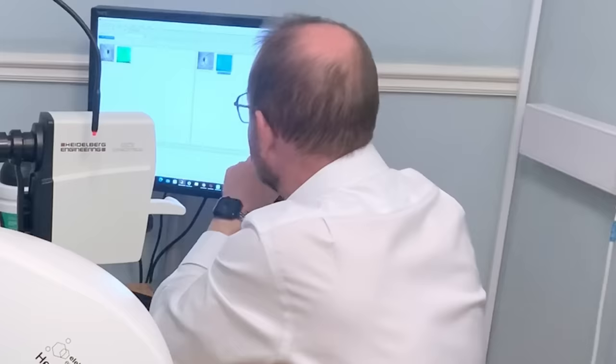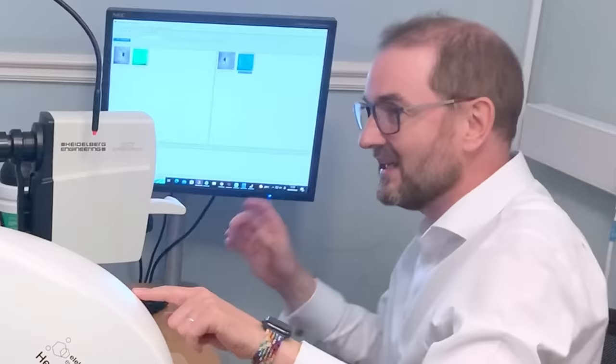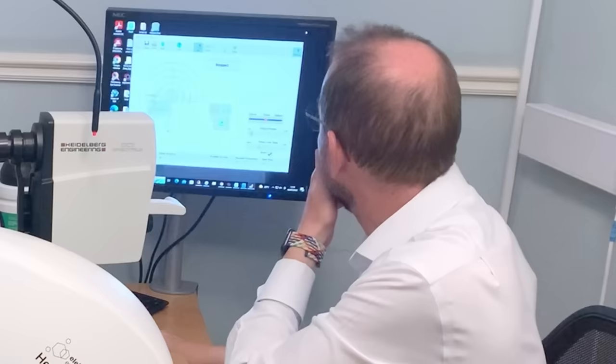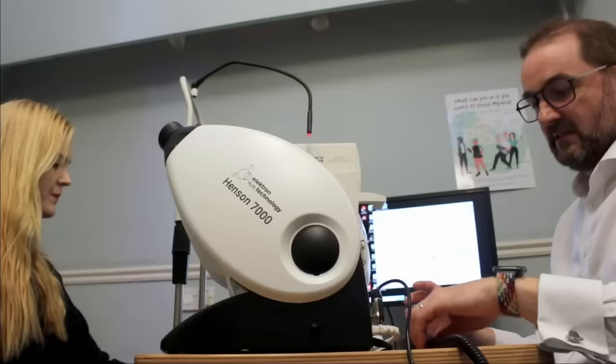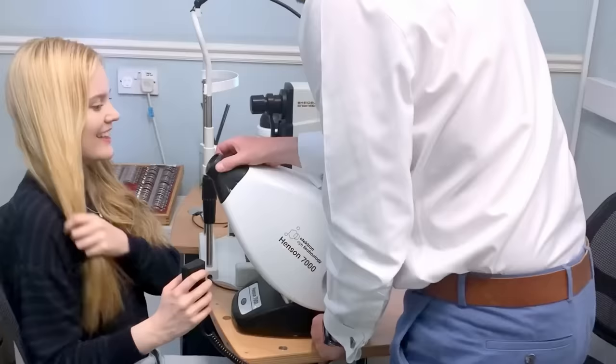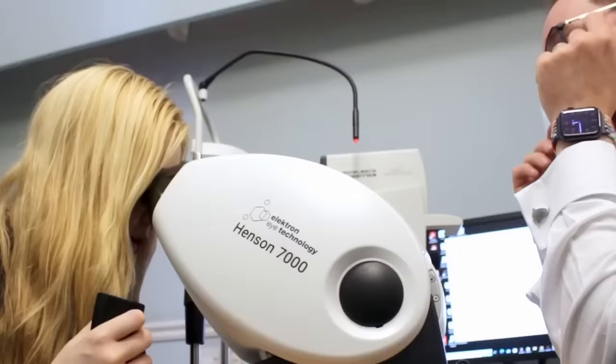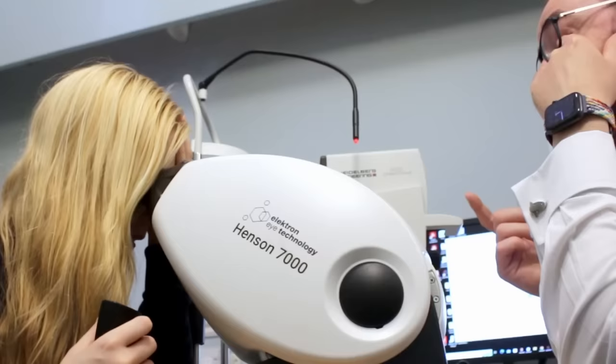All right, that's that one done. So now we want to do the visual field. This one's a bit more boring. It's a necessary must. You've probably had this one done where you press a button for the dots that you see. So let's do that. This is the button here. Press there, and I can move this up and down. You need to put your right eye in there first, and then close your left eye. You can use your finger just to hold your lid if you want, whatever's more comfortable.